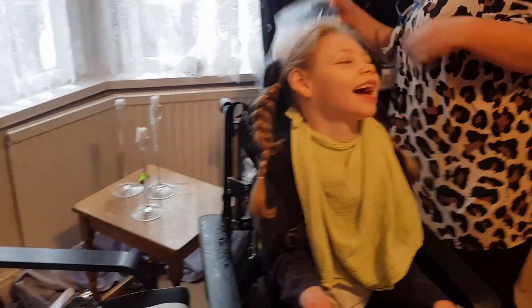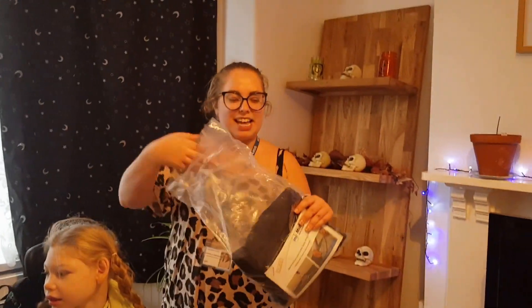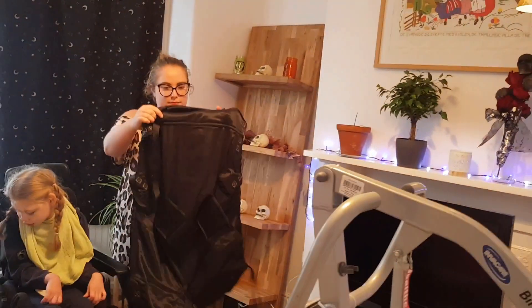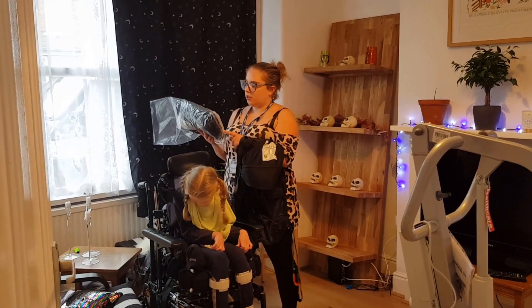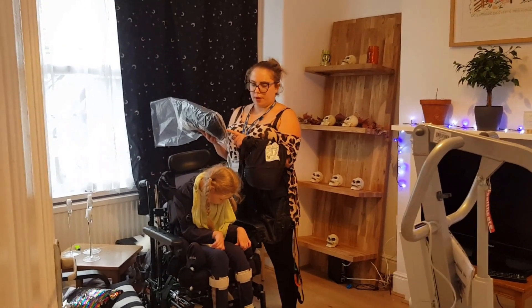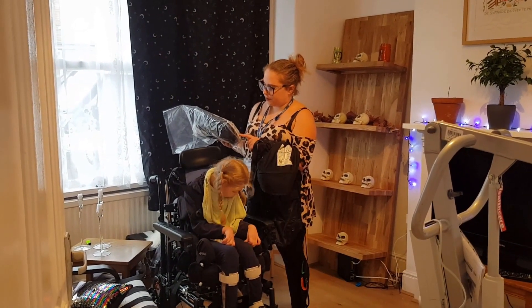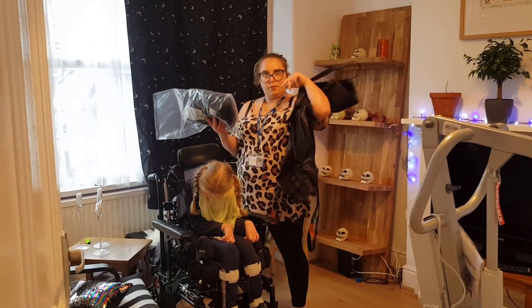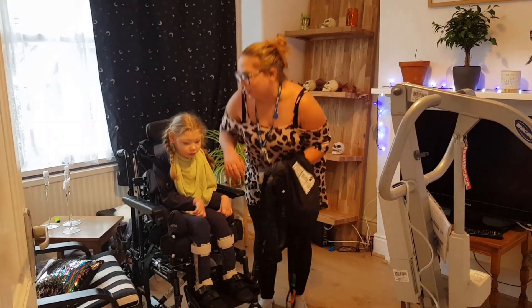We've got hoist slings. I think they're the same, or they are slightly different in terms of the straps. The one she has now is more supported. The one with the orange bits — her head isn't as supported; this is more of a toilet sling. The other one her head is more supported. So you've got the right one. Should we get this on her? She's like, yeah, whatever.